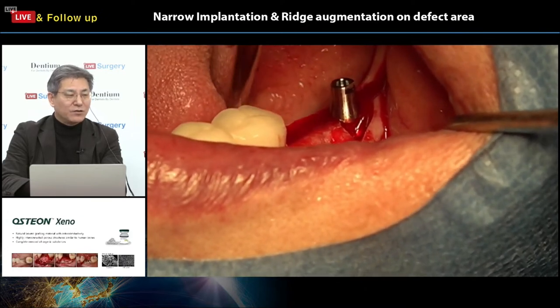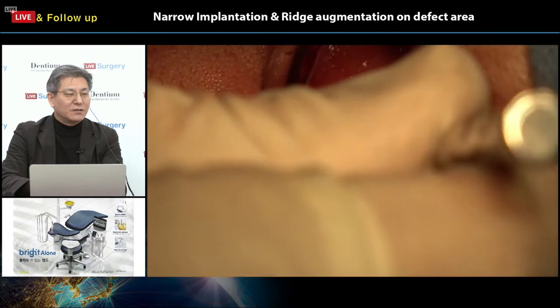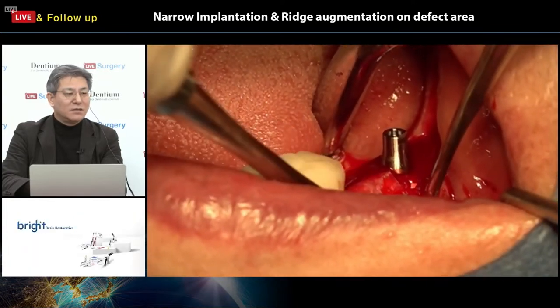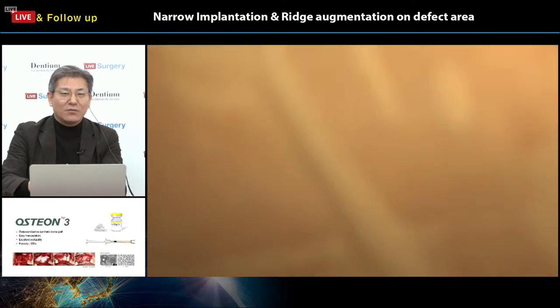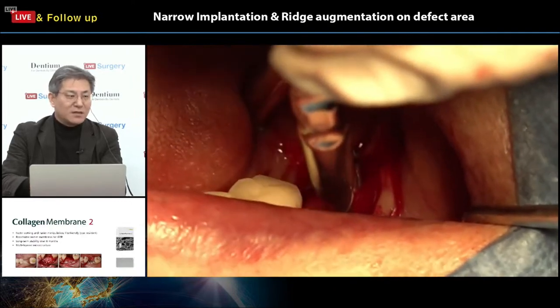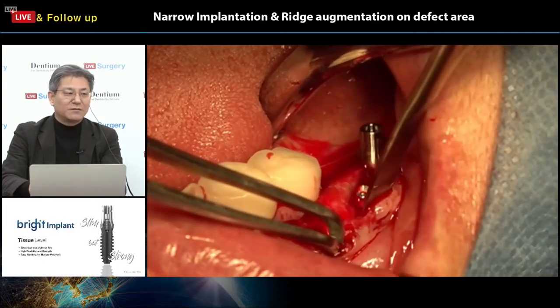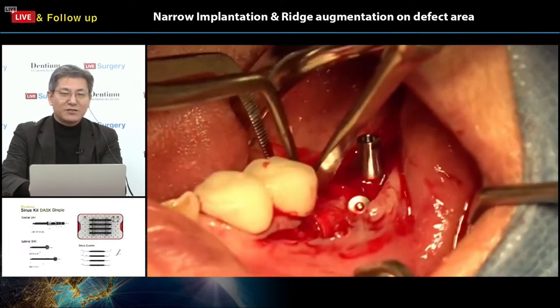Okay, I think he is also using the pin fixation. He is going to have pin fixation. You are able to learn how to deal with this kind of barrier membrane, how I can fix this membrane securely, how we can maintain space and stability for successful GBR. You are able to learn from today's surgery.